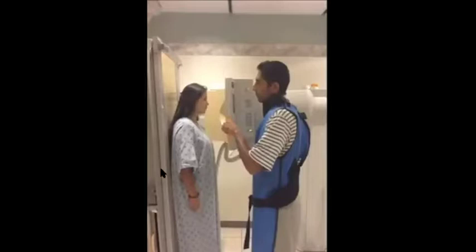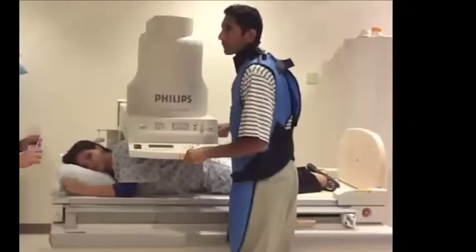Here, the patient is upright. The patient swallows in an upright position. Here's the position in an oblique position. In radiology, we like to have more than one view. So the patient swallows in the oblique position. The last part of the esophagram is the patient in a right anterior oblique position.